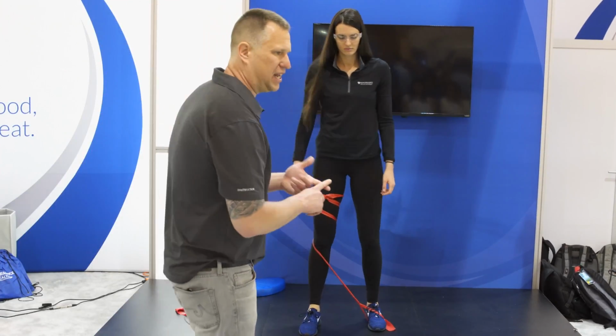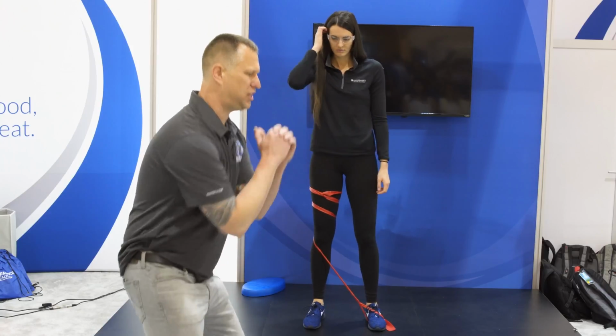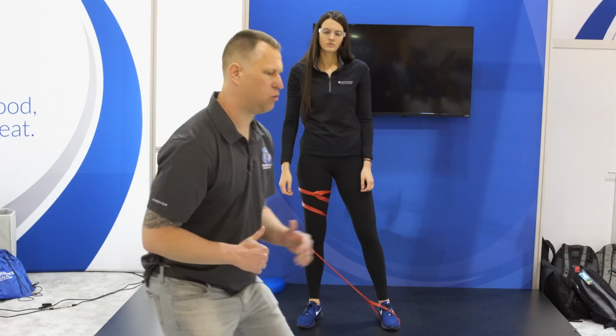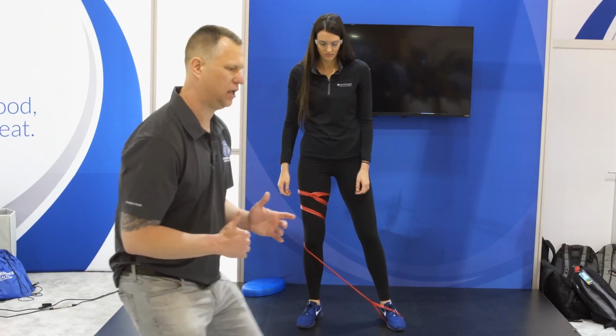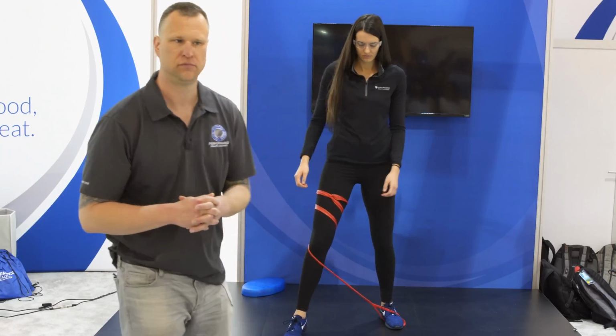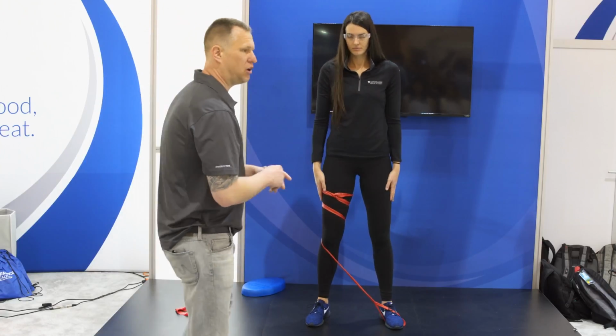So we talked about standing side by side, and then again, deep functional squat, and we can look at eyes closed, eyes open, but we can also work on step forward and step back. It doesn't have to be always a side to side motion or always a stepping motion, okay?